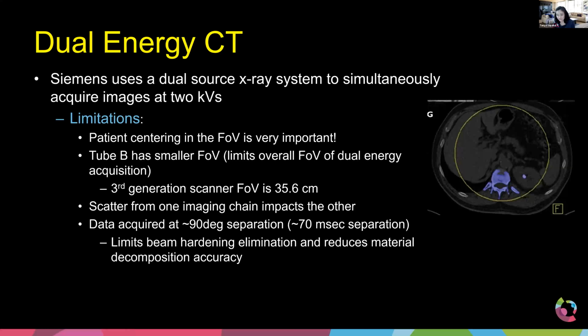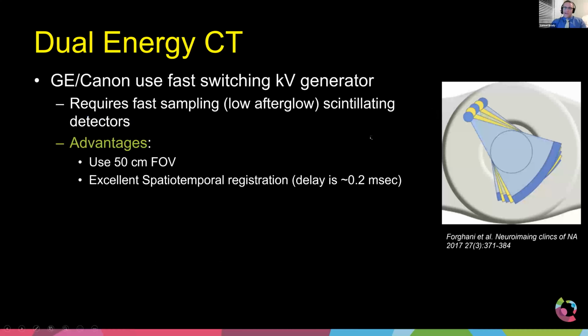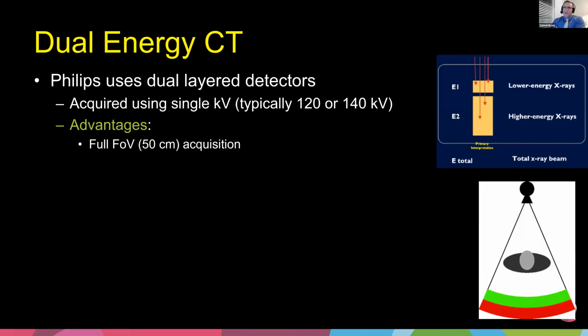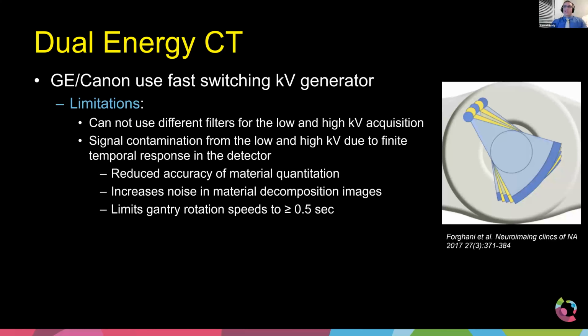Yep, it is. And so, like I said, it really depends on the type of scanner you get. If you are someone that thinks dual energy is really the future, but you don't quite know how you're going to use dual energy on every one of your patients, then this scanner is probably not the best scanner to have. It might be the Philips scanner, this one, because with this one, you can do dual energy on every patient, and you can just turn it on and off whenever you want. If you do know exactly why you're going to use dual energy, but your patient population is larger, then this might be the scanner you need.